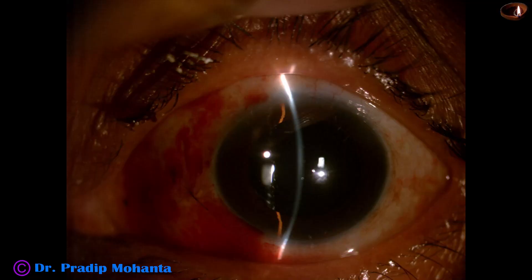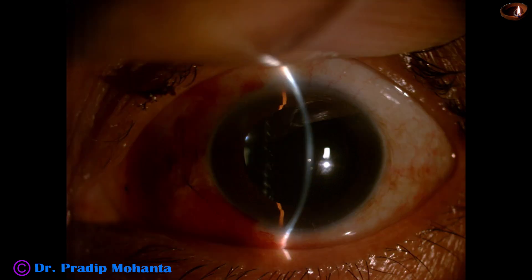Now see the post-op pictures. The cornea is clear — no corneal edema. This is the beauty of pars plana anterior vitrectomy: there will be no corneal edema if you do vitrectomy from the pars plana. The optic nerve and macula are fine. The patient is achieving 6/12 unaided vision.